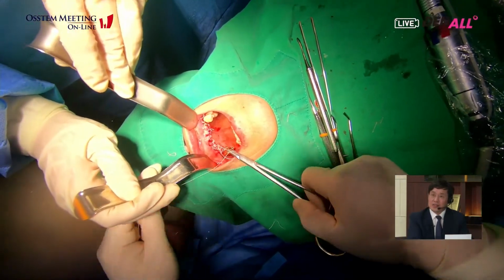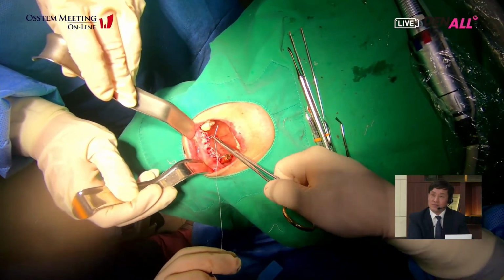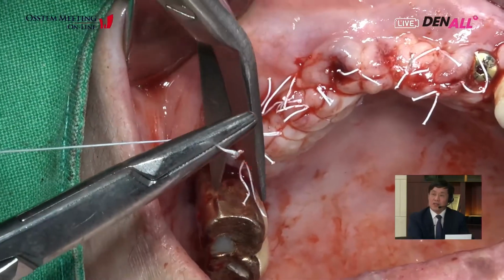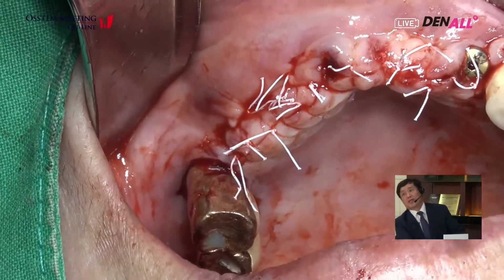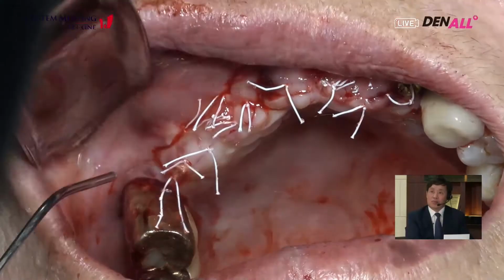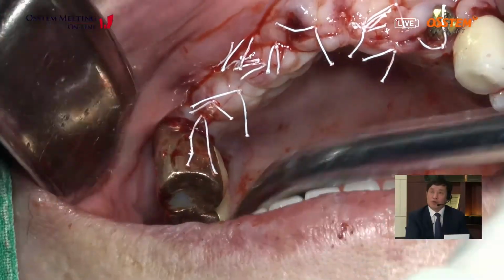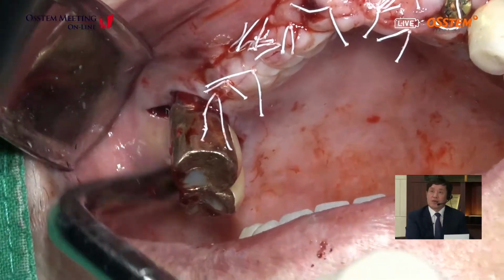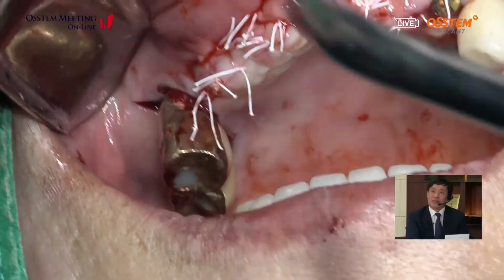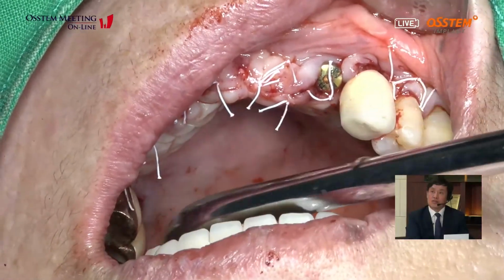I will close the vertical incision from the right side. Yeah, that will be a final suture. Dr. Kim has already almost finished the sutures and the approximation of the flap for the primary closure. After that, he will do the vertical releasing incision sutures.